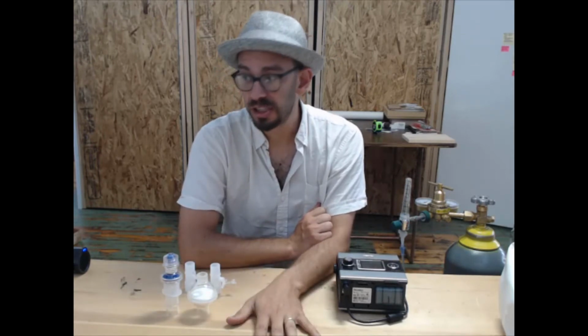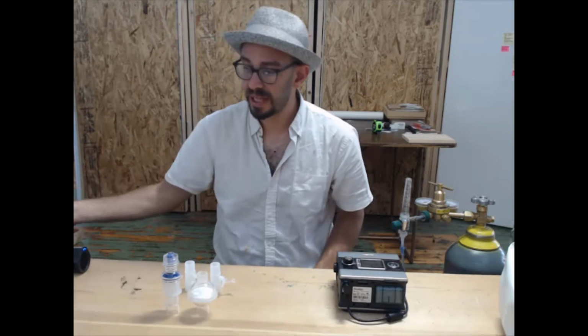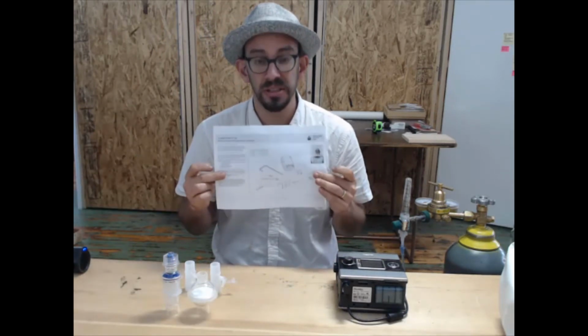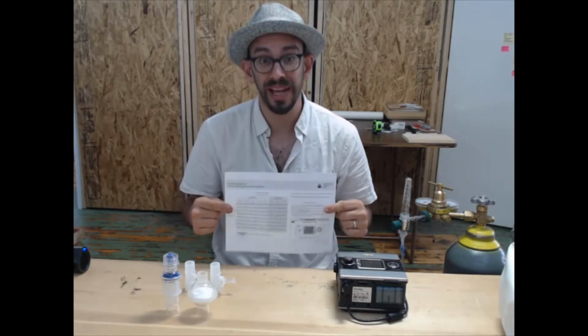So let's go through the patient circuit. What you'll see included in your kit is a number of parts and also a reference card that shows how to assemble the patient circuit and an operating table showing how to operate it.